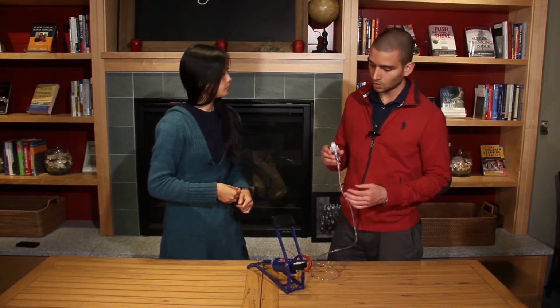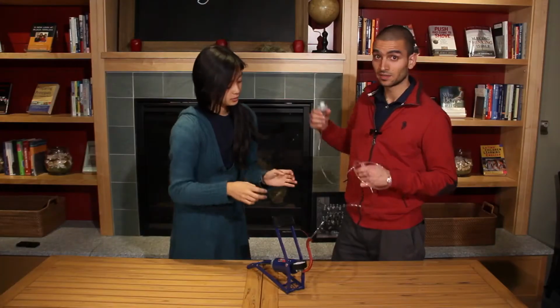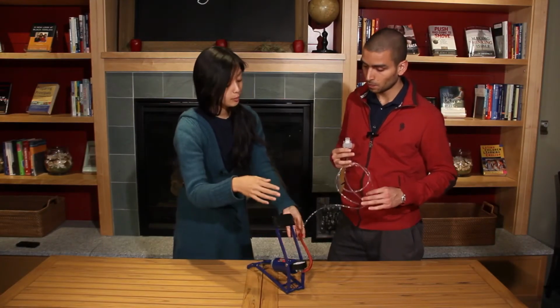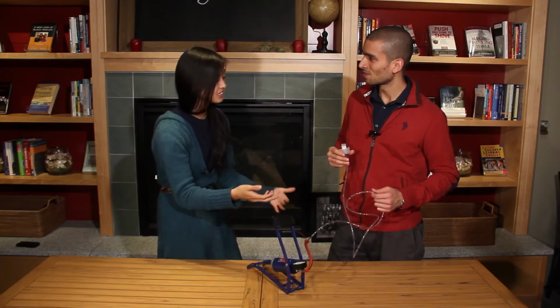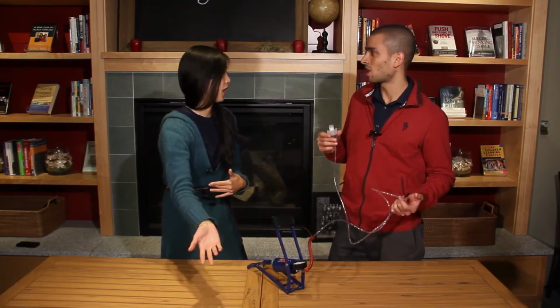Right. So what are the components of the nebulizer? In this case we have a piece that's from a normal nebulizer. Okay, this thing here. Exactly. And you'll see it in action very soon. And then we have a filter here, because we're going to put compressed air through it using a bike pump. So instead of using a fancy machine that needs electricity, this is just something that you can step on to pump your tires. Yeah, exactly.